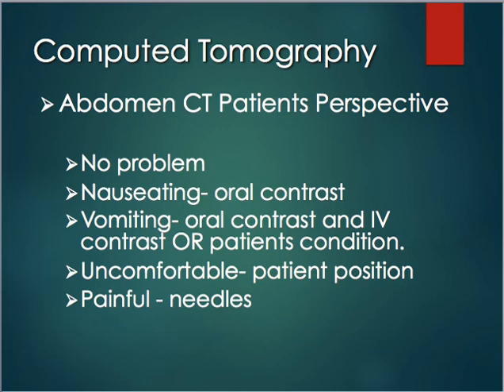So abdomen CTs can really be easy and simple, there's no problem, or they can have severe issues with the patients. The oral contrast can make the patient very nauseated. So they might not be able to lay down, they might feel like they're going to throw up, they might even vomit. It's just going to depend on the patient. Again, if a patient's having severe abdominal pain, it's going to be hard for them to lay on that table flat. And then it could also be painful from the needles.